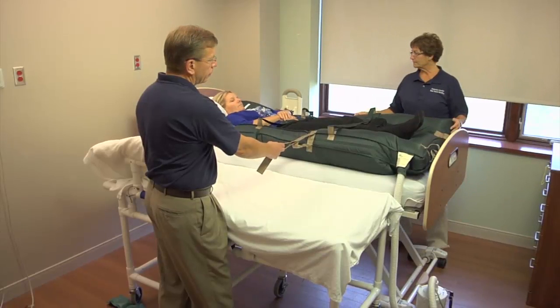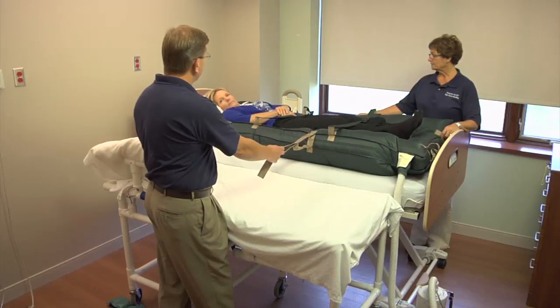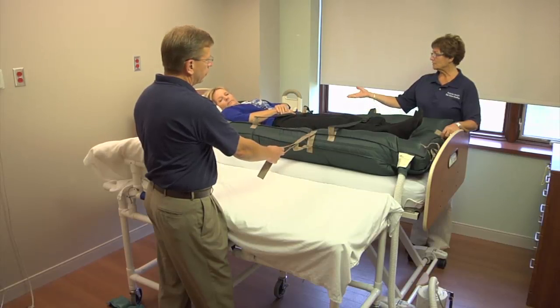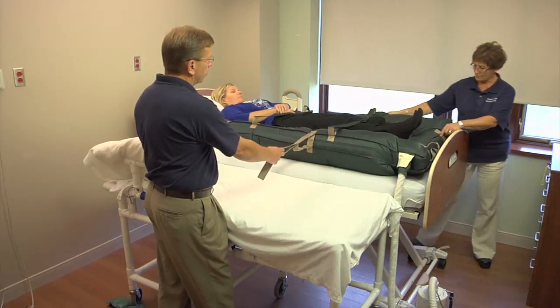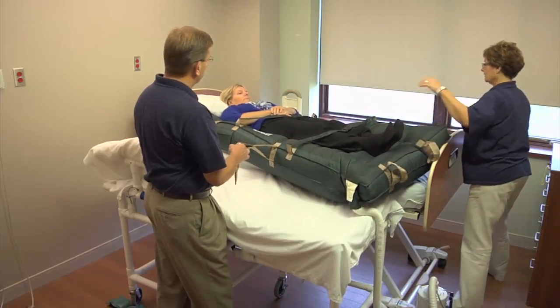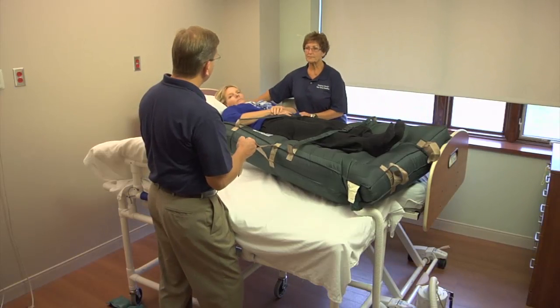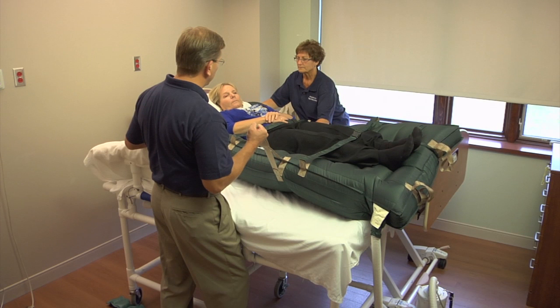So you can see how a patient could be safely transferred from one surface to another. We always ensure that the brakes are on. We bridge the gap with a slide board. We have the bed higher than the bath cart or gurney the patient is going to. We move the feet first, leaving the head over a safe surface. Working as a team, you slowly transfer the patient out of the bed.